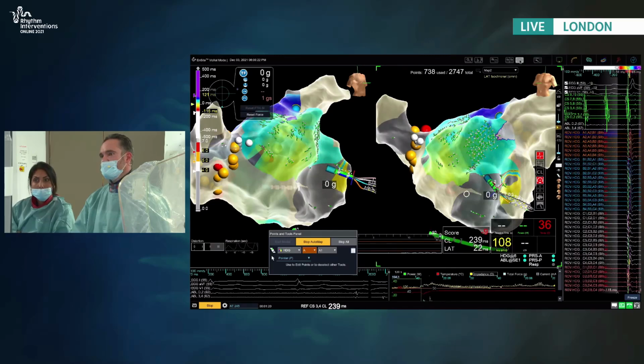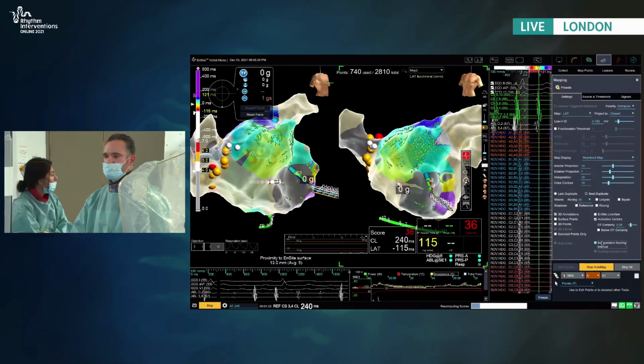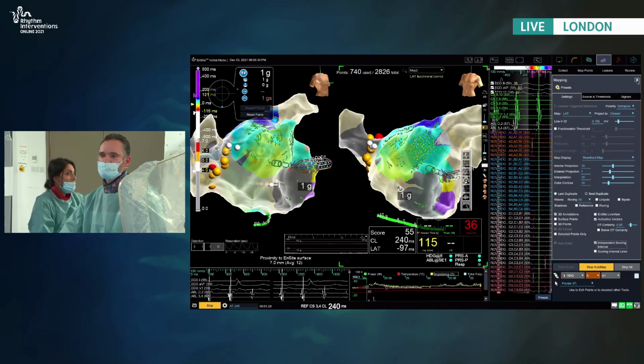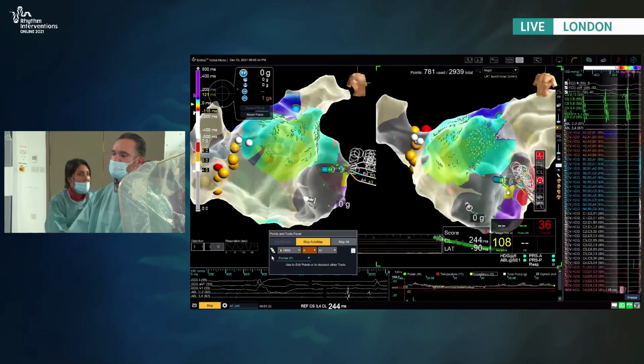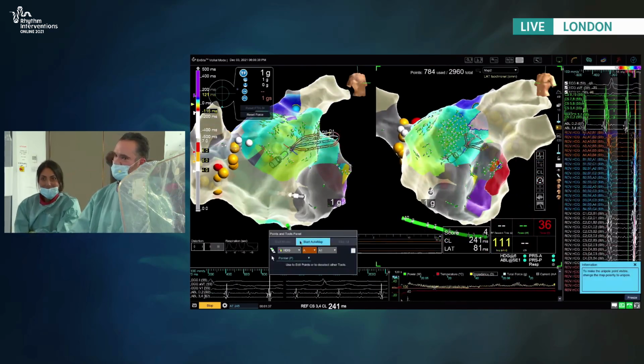So let me ask you, Ross, Hugh, when you do a redo procedure, then I apologize. Hugh, maybe a follow-up. Sorry, Jan, let me just go back to Ross, into your main job. Ross, sorry, I just want you to explain to the fellows that may be watching what you're up to now. And say that again, sorry? I just want you to describe to the fellows what's happening.